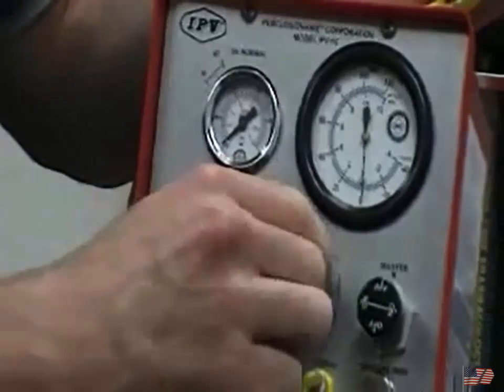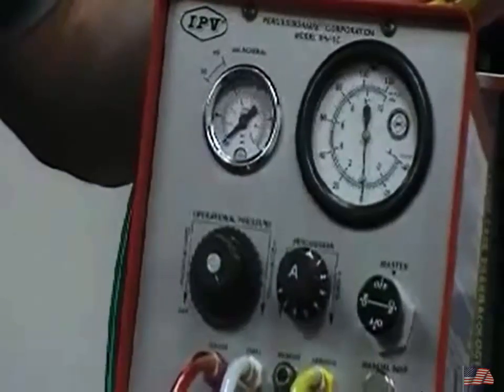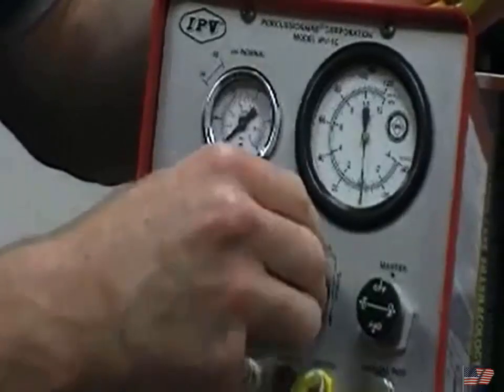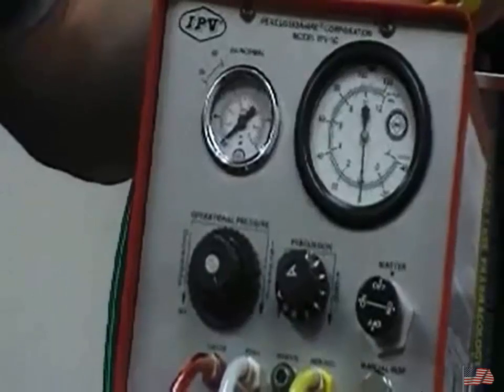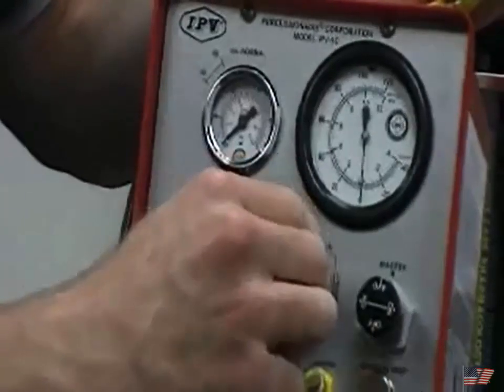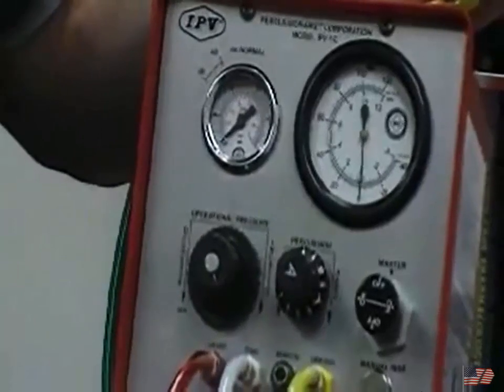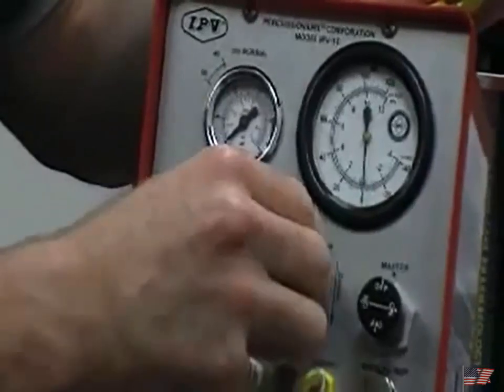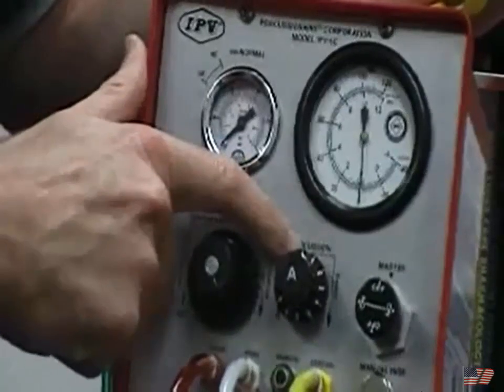Your percussion level, how much we manipulate that mean airway pressure. So we've got an easy setting, which makes the mean airway pressure go a little more faster, less fluctuations in mean airway pressure. A harder setting makes the mean airway pressure fluctuate more. Typically, there's an arrow up here, and I just set that at high noon.